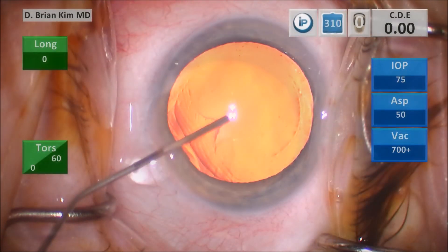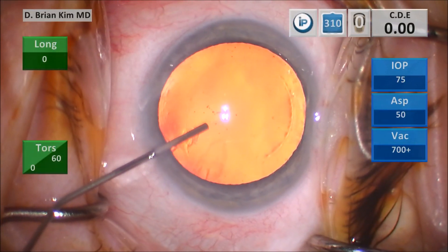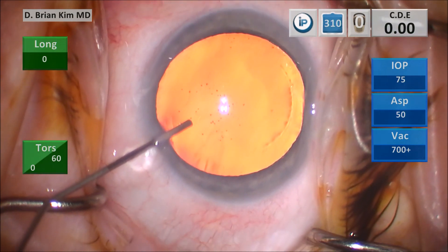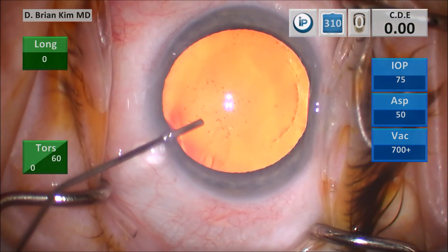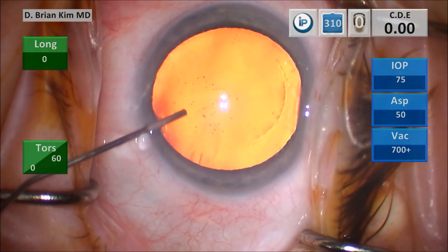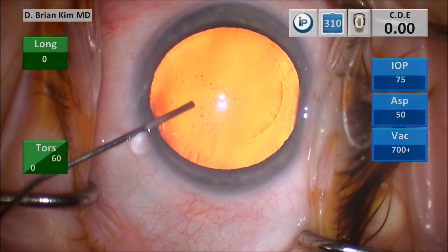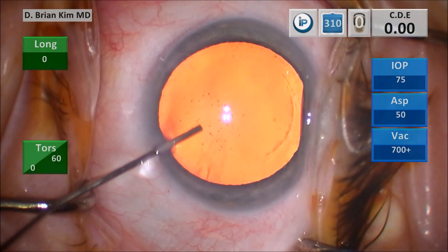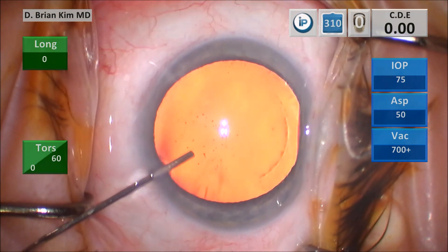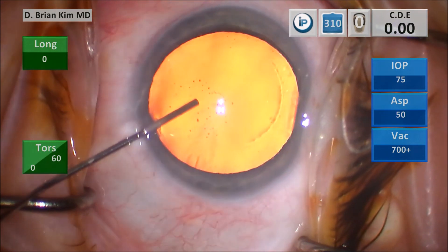That happened fairly quickly, so let's show this in slow motion. This step is where you're placing your dispersive viscoelastic in the anterior chamber after you've made all of your incisions. I used to use a fixation ring, but with the help of colleagues on the ASCRS listserv and hearing what other people are doing, I chose to use a cannula instead to fixate the eye.